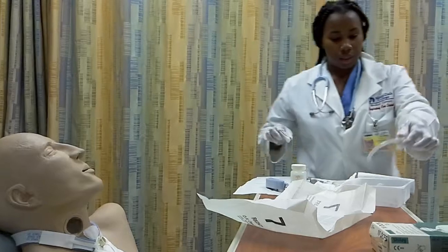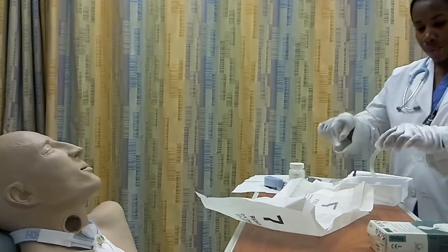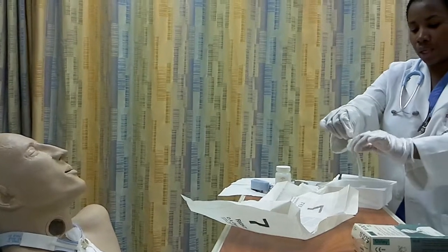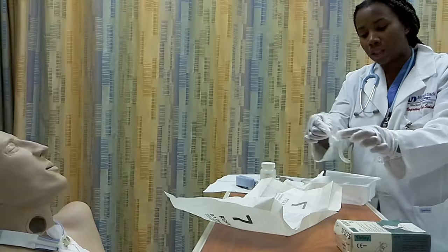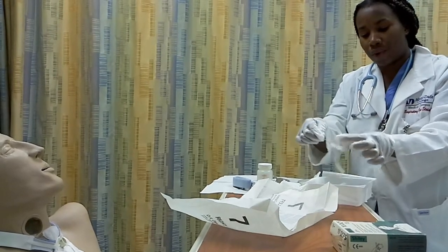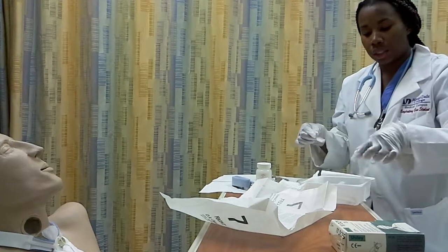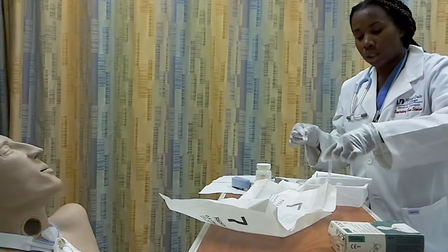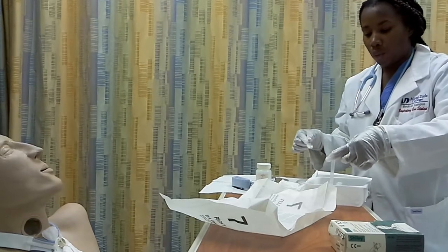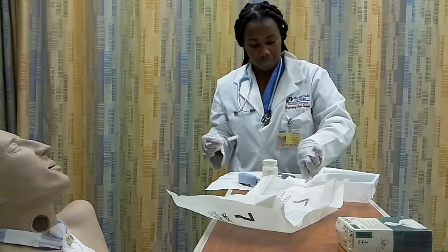I'm going to go right here and dip this in the hydrogen peroxide, and then I'm going to get my scrub brush and scrub the inside of the cannula. I'm also going to scrub the lumen to make sure I get all of the mucus out of there. I'm going to dip it back in the hydrogen peroxide, then dip it in the sterile water to rinse it, and then dip it in this sterile water to get the excess liquid off, and I'm going to set it aside so it can dry.